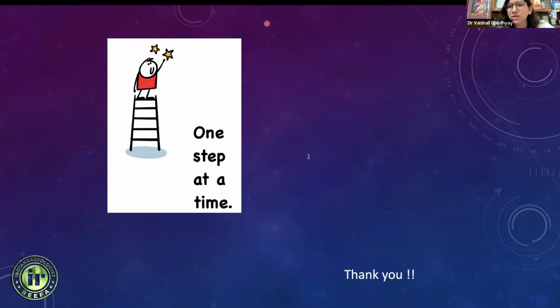So I don't use these words, acute tendinosis or sprain. When it's tendinosis, that is what I just described, I refer to it as tendinosis. And when it's a tear, then I call it a tear and I describe it in the way that I just told you, whether it is a partial thickness tear and mention the depth of the tear, and whether it's a full thickness tear, it is complete or incomplete. I don't use these terms.